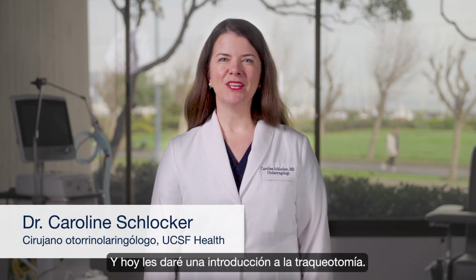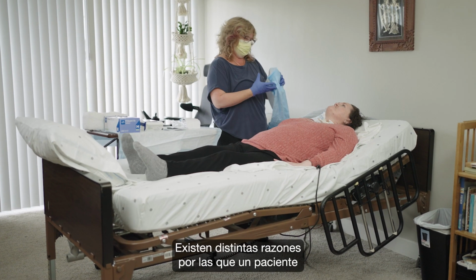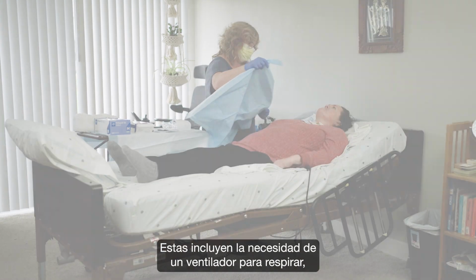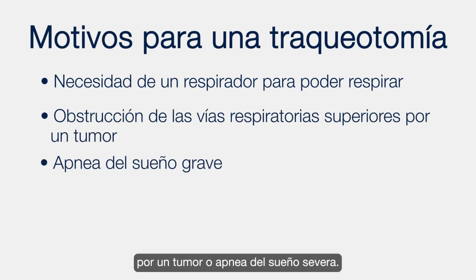Today, I will be giving you an introduction to tracheostomy. A tracheostomy provides airway access through the neck. There are several different reasons a patient may need a tracheostomy. These reasons include requiring a ventilator to breathe, upper airway obstruction from a tumor, or severe sleep apnea.